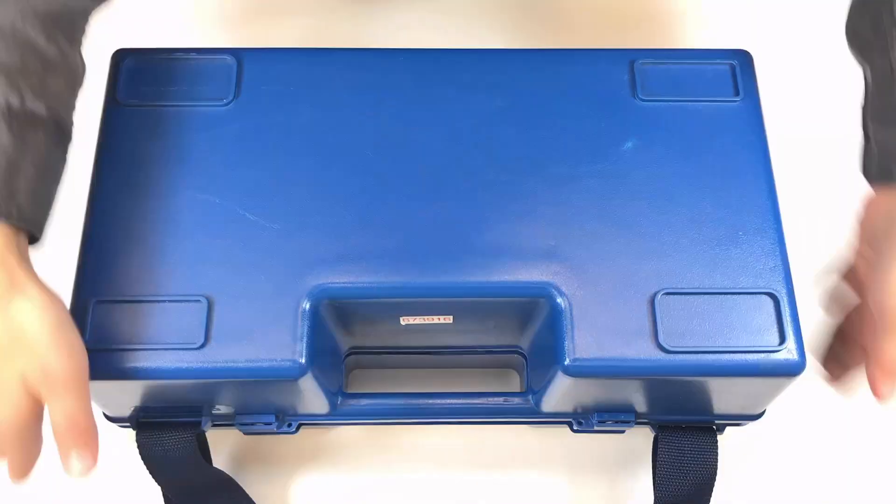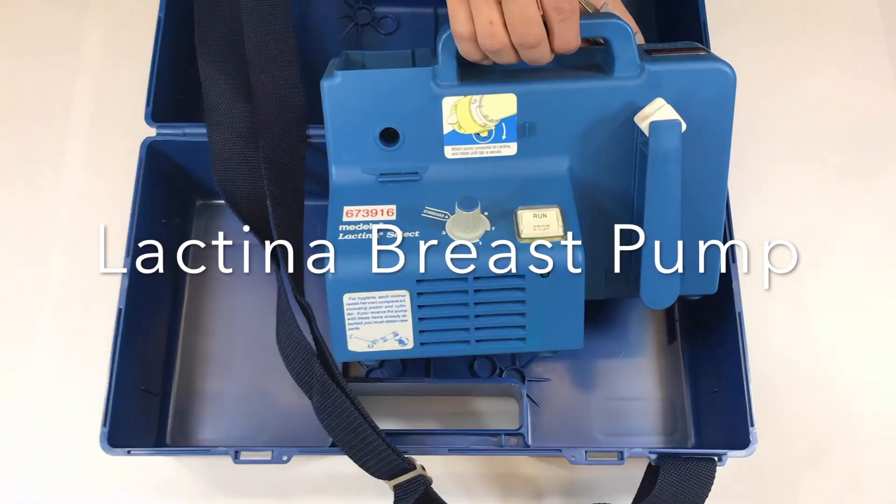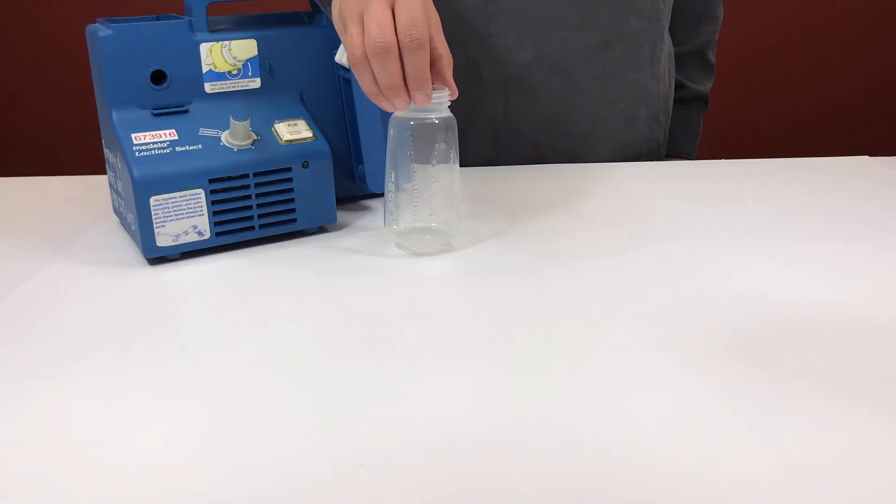Today I will show you how to put together the Lactina breast pump and how to get started. Let's take a look at the pieces that come with the kit.